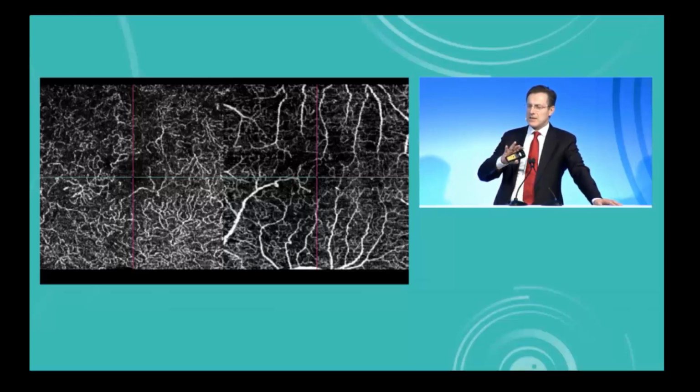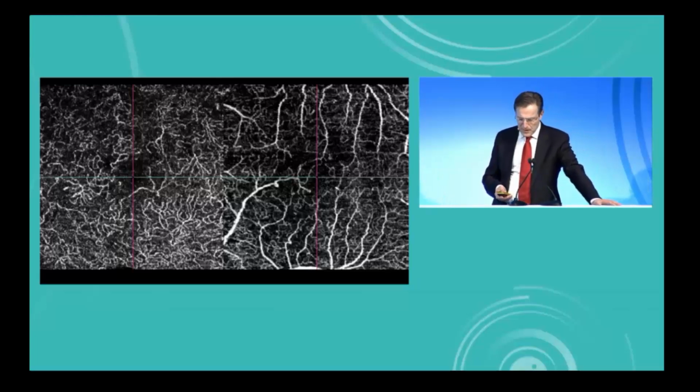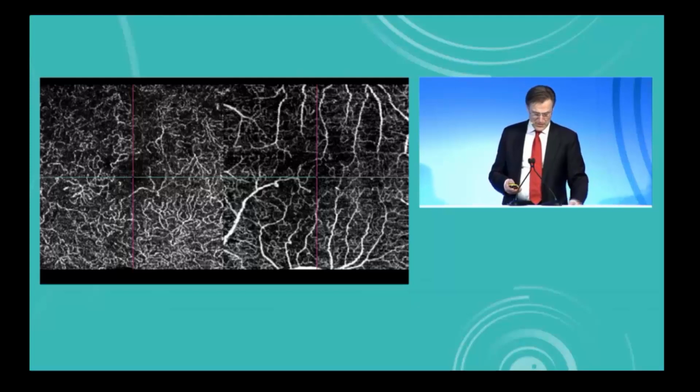And there is an entirely new endpoint here for following the early stages of diabetes and diabetic retinopathy in a manner that we have never previously had access to. And it's going to be interesting to see how it can change diabetology perhaps, and help us prevent the sight-threatening stages of diabetic retinopathy from threatening our patients.